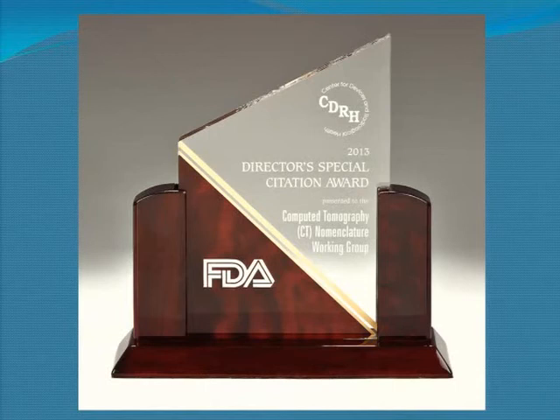What we do, the best thing would be to use some kind of attenuation measure, right? Because it's really the patient attenuation that should drive your technique for that patient. And we initially thought patient circumference in the middle of the scan region would make a lot of sense. And we had thought we would supply tape measures to all the rooms, knowing that they would disappear in like 30 seconds. But that was kind of our initial thought.